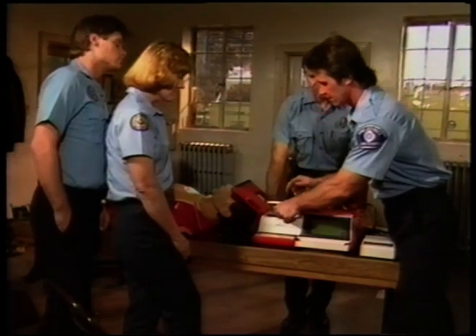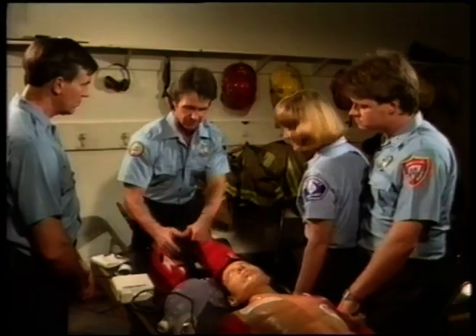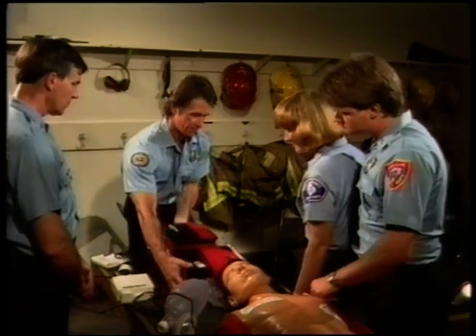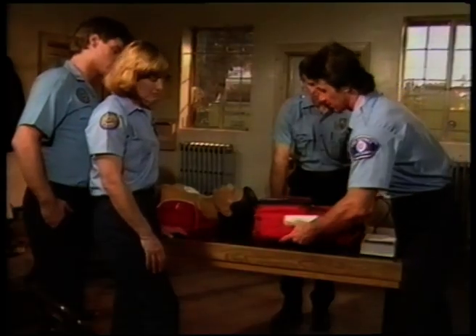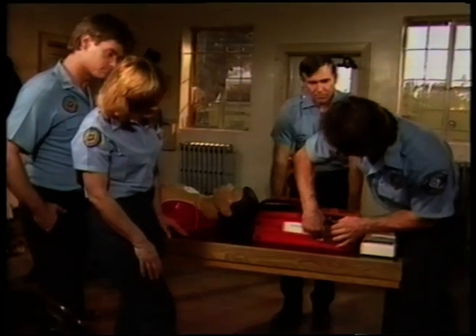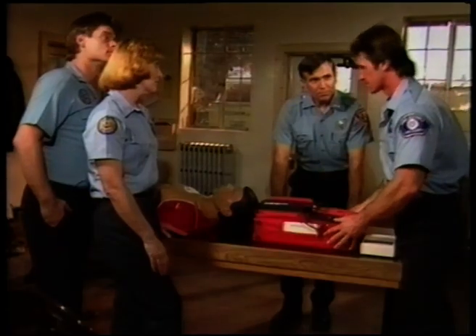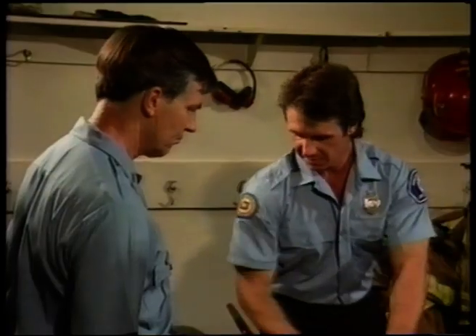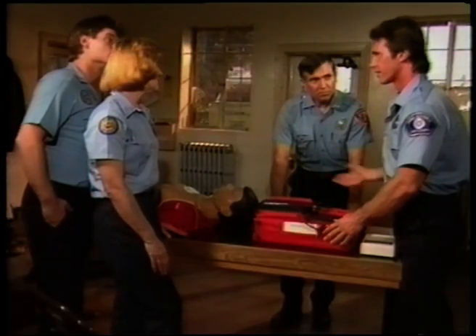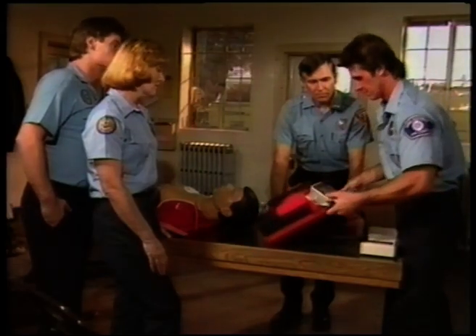Don't forget to replace the original cassette tape with the wound portion of the tape on the right. After any testing, recharge the depleted battery before placing it back into service by plugging it into a charger. This sealed lead-acid battery functions best if continuously charged. If the battery cannot be continuously charged and it has not been used or recharged over the last 30 days, rotate it with a fully charged battery. Charge and store batteries in an area with ambient temperatures of approximately 60 to 75 degrees Fahrenheit because temperature extremes will damage the battery's performance.